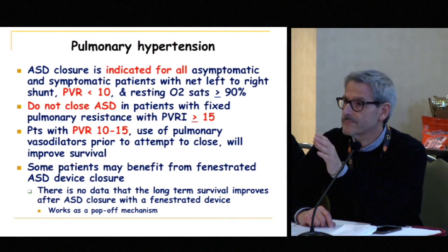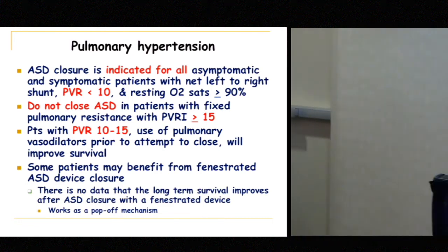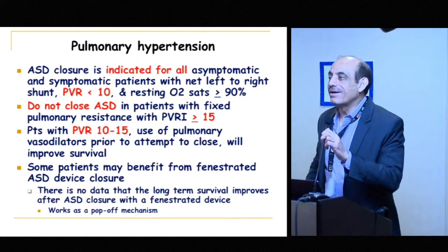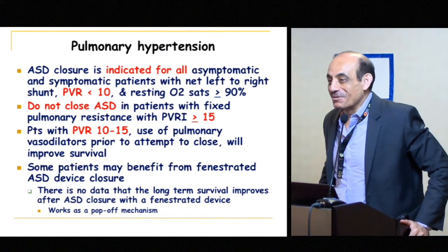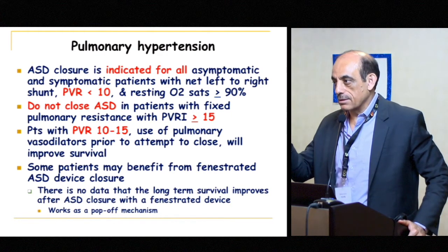Yes. So, a couple of questions that have to do with each other. The first, and I don't know if I heard you right, did you say you normally don't balloon size ASDs? Oh, God. Yes, I do not balloon size. I balloon size every PFO. I don't balloon size ASDs unless for a couple of case scenarios.